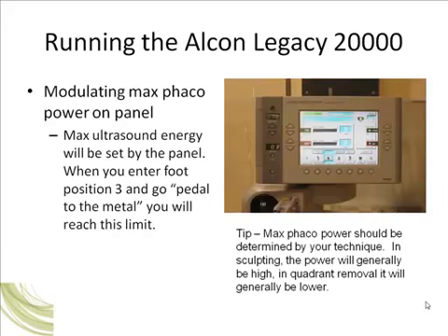One of the variables during phacoemulsification that you need to become familiar with is the phaco or ultrasound power. That's shown here on the screen. As you can see here, the ultrasound power actual is listed there in the blue box. The maximum limit is shown in the small black box. The max ultrasound level is set on the panel by adjusting the buttons, or comes preset in various phaco modes that could be set, custom modes that you could program later.